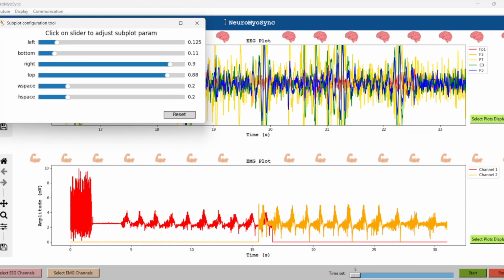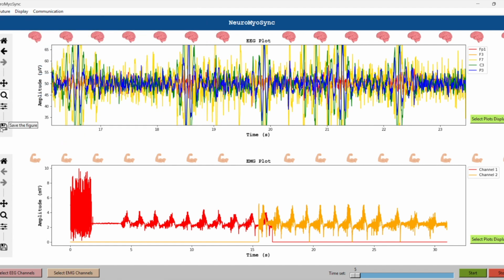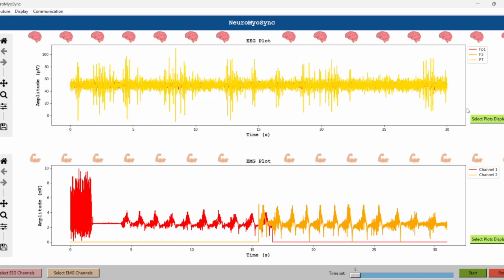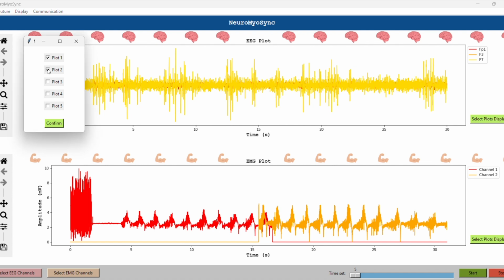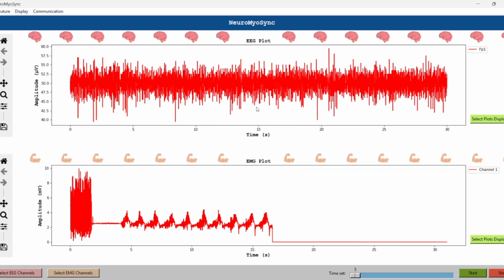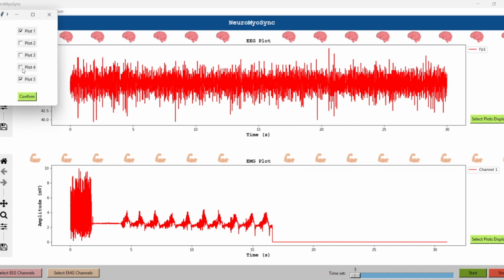This allows you to configure the display, and here you can save the figure as an image file. Here you can select which plots you would like displayed if you want to focus in on certain data or a certain channel. And here you can do the same thing as well with the EMG data.